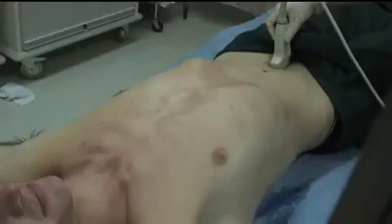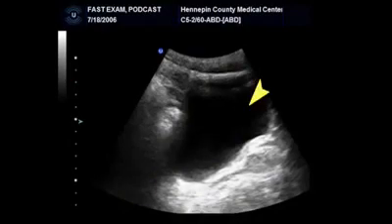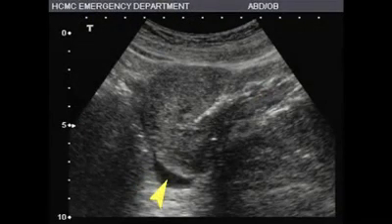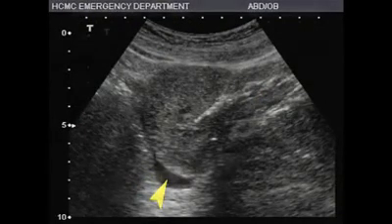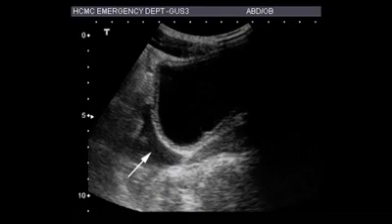In the pelvic view, the ultrasound probe should be placed directly superior to the pubic symphysis in the longitudinal position. A normal view will visualize the bladder, uterus, and posterior cul-de-sac in females. In males, the bladder and retrovesicular space are visualized. Intraperitoneal fluid will collect in the posterior cul-de-sac, or pouch of Douglas, in females, and in the retrovesicular pouch in males. This view is not useful if the bladder is empty and should be performed before Foley catheter placement.